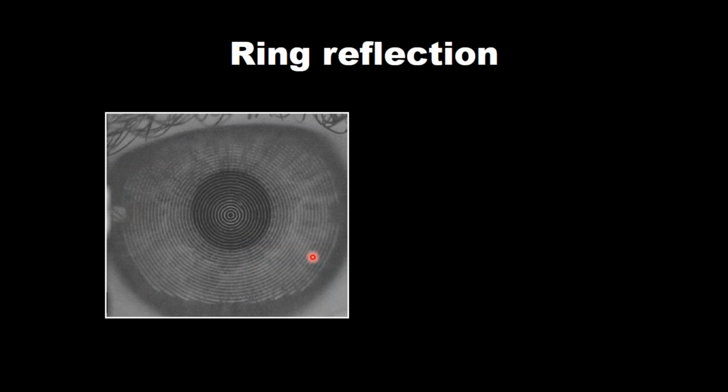Next, once you've got your photo, you want to focus in on these central rings. What the topographer does, reflection-based topography, is they build the shape and elevation of the eye from the center to the periphery. So the center becomes sea level, and understanding the height, shape, and elevation of the eye all the way to the periphery is critically important to have those quality central readings in order to create the construction that we desire.